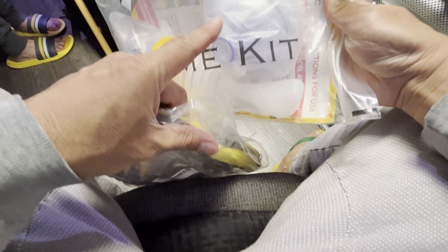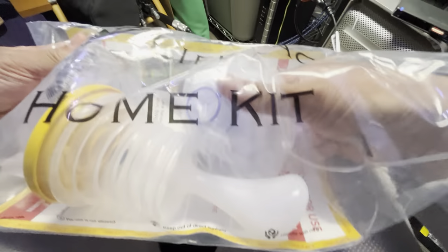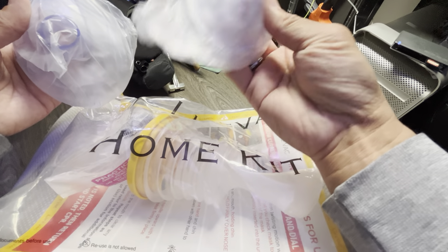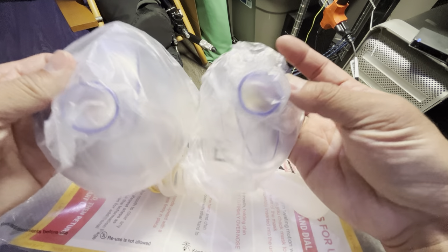I believe the home LifeVac has an extra mask compared to the Travel case. So let me just briefly pull out some of the items. In the masks, you have different sizes — you have a small pediatric or infant size for a small child, and I believe you have an adult size here. You can utilize this for the size of the individual.